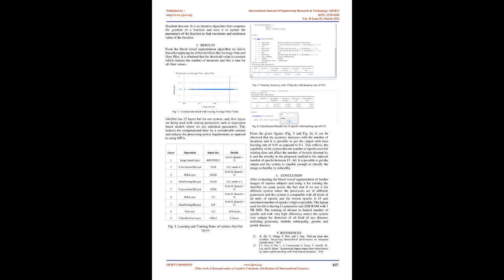In the first stage, we are calculating the mean intensity of the image and using that for the threshold of the pixels. After that, the mean above threshold and mean below threshold is calculated because we want a complete noise removal from all the images in the datasets. In the second stage, we are calculating the normalization for the range in I1.